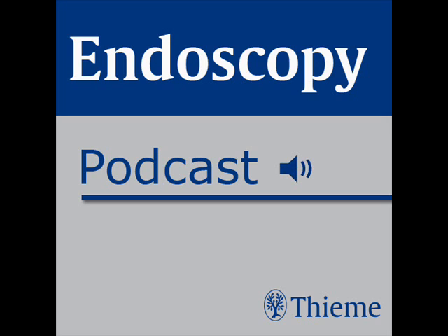Ideally, endoscopic resection and radiofrequency ablation should be performed in a single session prior to the development of scar tissue during the healing process. However, when radiofrequency ablation is performed immediately after endoscopic resection, the resection wound, which is as deep as the submucosal layer, will be ablated, which may hold a risk for severe stenosis or even perforation.